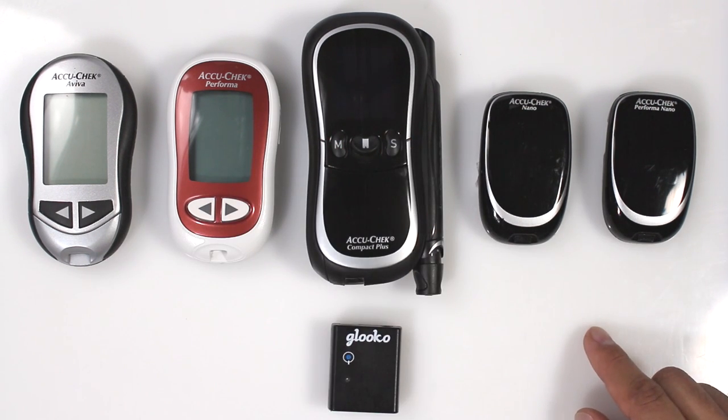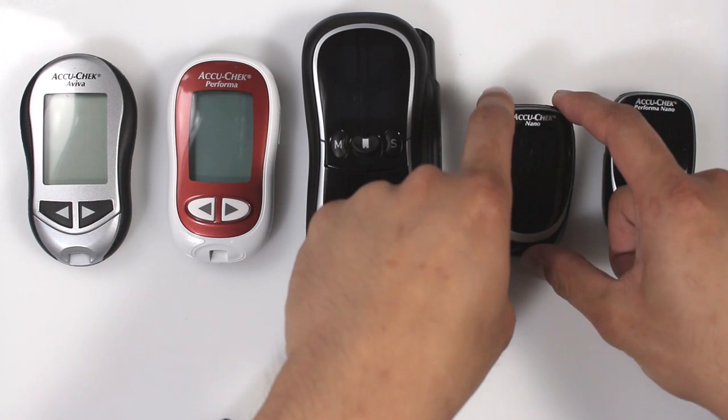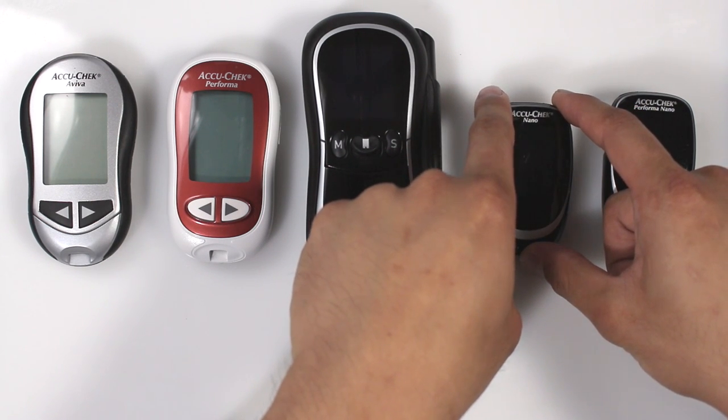For the AccuCheck Nano, press and hold the top left and right buttons until you see the Sync icons appear.